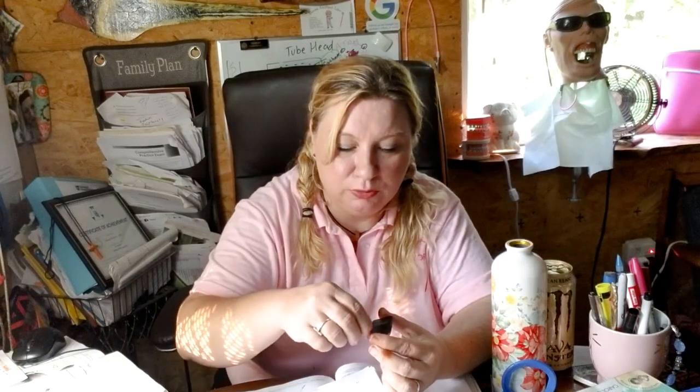Remember, you can also use a coin test. You take a couple of different films, you go in the dark room, you put a quarter on top of the film packet, white side up, because that's the side that would be facing the PID, which is what? The position indicating device, which is the part that goes up against the patient's cheek. You shut the light off and let it sit there. Then you process the films. It's still in the dark. When it comes out, if you can see an image, you have a light leak somewhere.